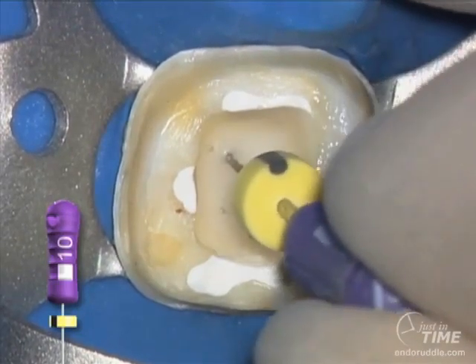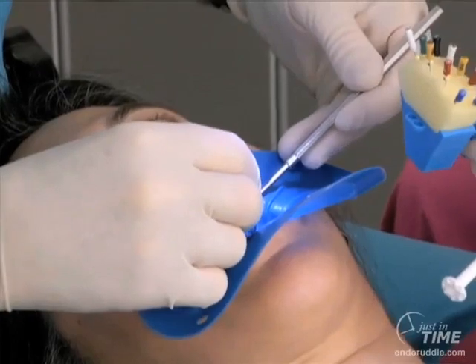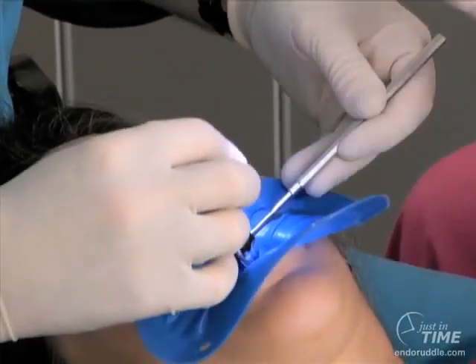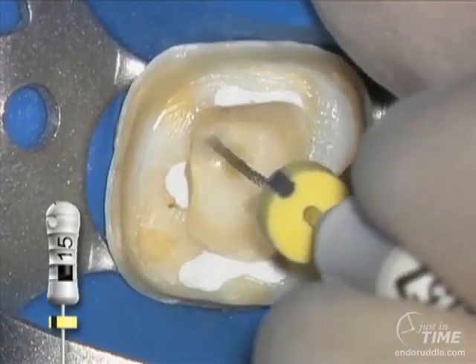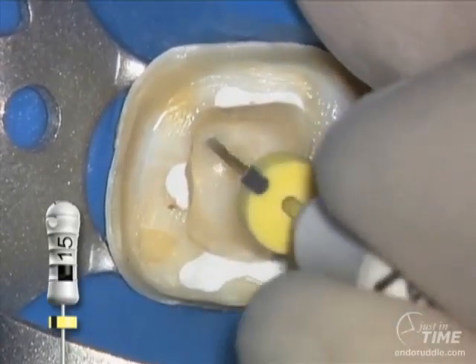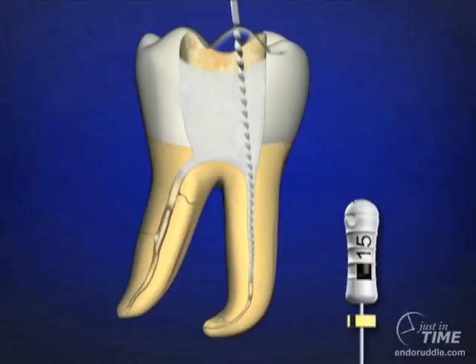By reciprocating the handle gently, that'll draw the file down into the canal. When the handle is just snug, pull. So we speak of feed it in, pull, feed it in a little bit deeper, pull. Each feed it in, pull is a cutting cycle. And I use 6 cutting cycles with the 10, followed by 6 cutting cycles with the 15. Each cutting cycle serves to smooth and expand and refine the glide path.